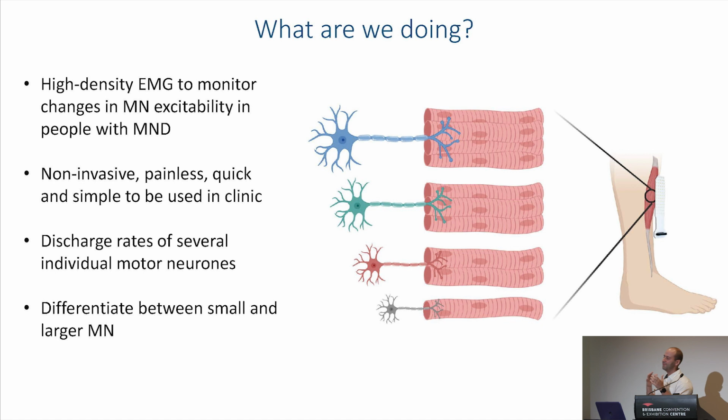Because you have so much data from different points, you can then put that into an algorithm. And that's non-invasive. It's painless, so you don't have to put needles in anyone. It's quick and quiet. You can get a measurement done in 10 minutes in the hospital.